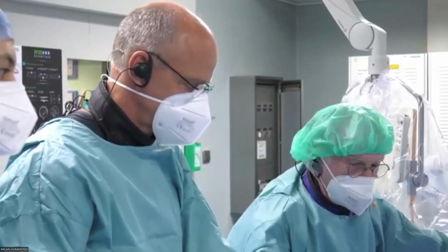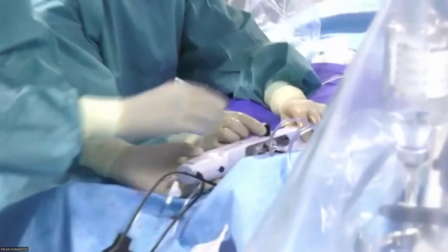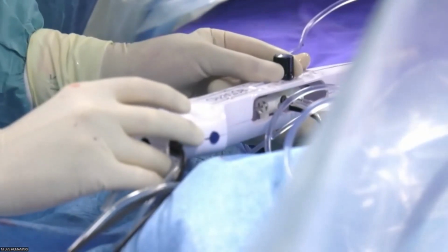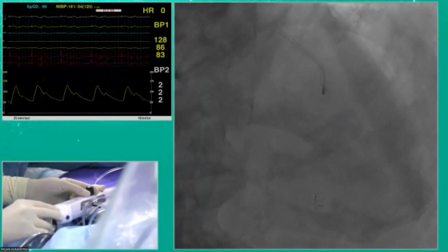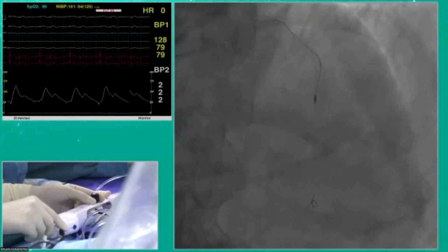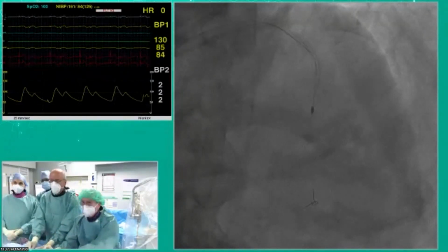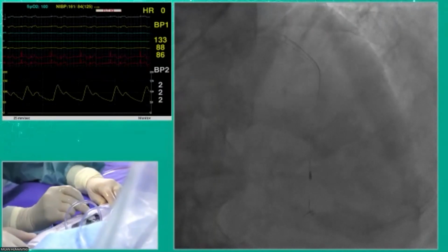The way I do to gain length is to open these. Okay, Bernard will hold these without looking, just keeping these in the center. And I will go distally with DynaGlide or without? Without, with speed. You press the button. Okay, stop. Okay, I gained a little bit. So this is a way to gain quite a bit. Okay, there we go. Nicely done.